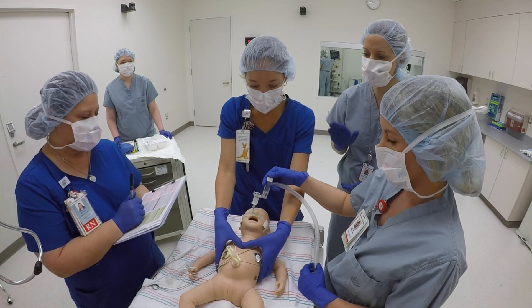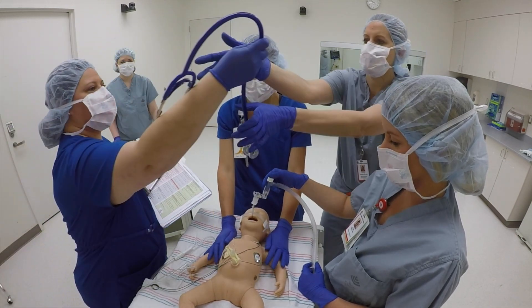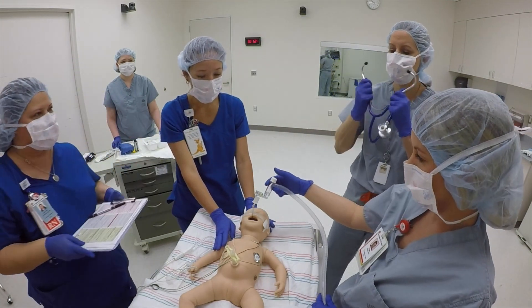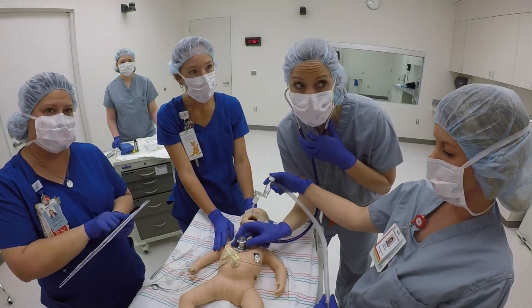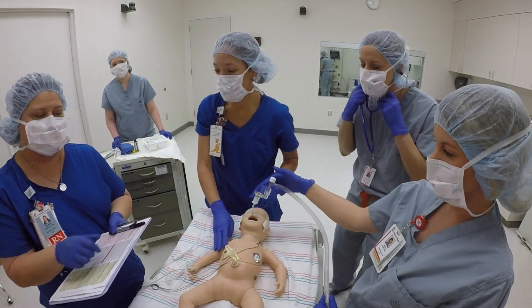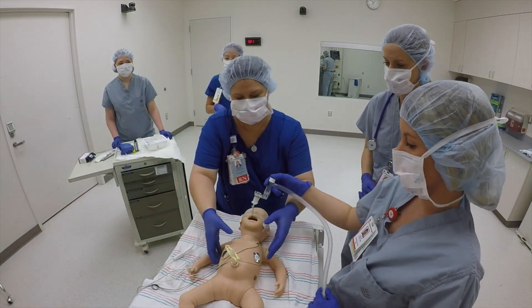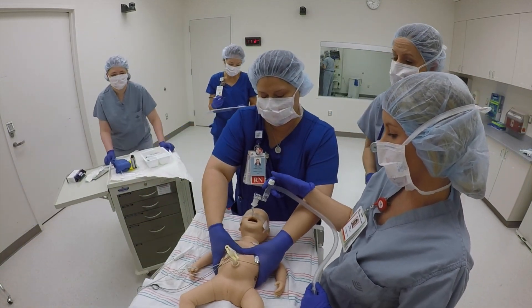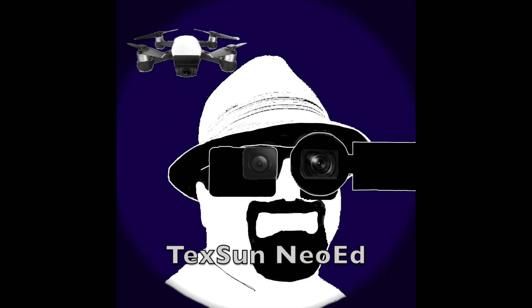It's been a minute of chest compressions. Let's pause chest compressions and continue ventilation. Our heart rate is still less than 60. Let's please continue chest compressions. Delinda, will you please take over chest compressions? Regine, would you come place the UVC please. 1 and 2 and 3 and breathe.